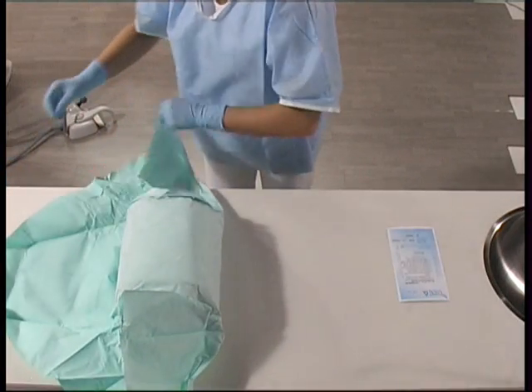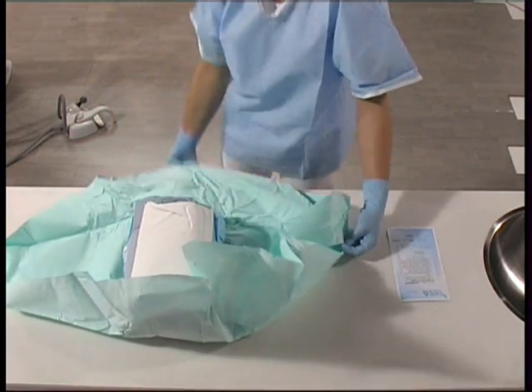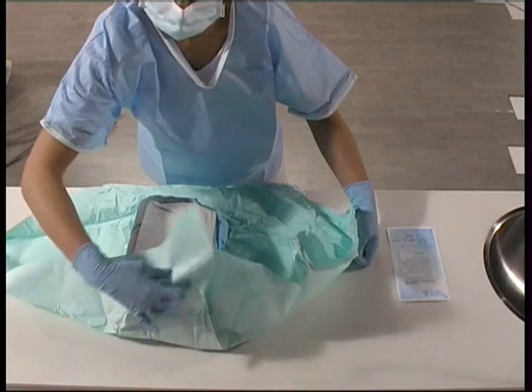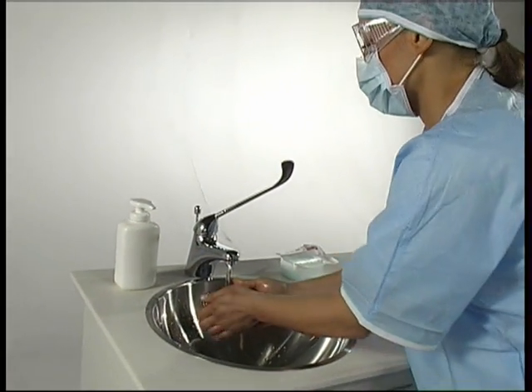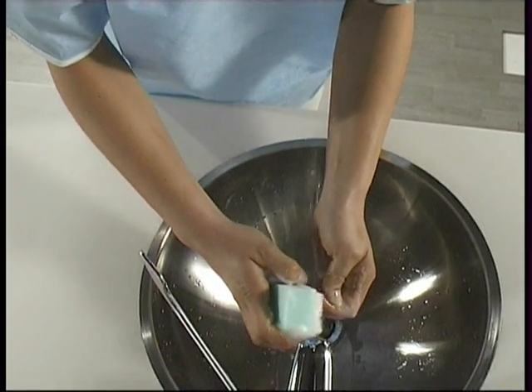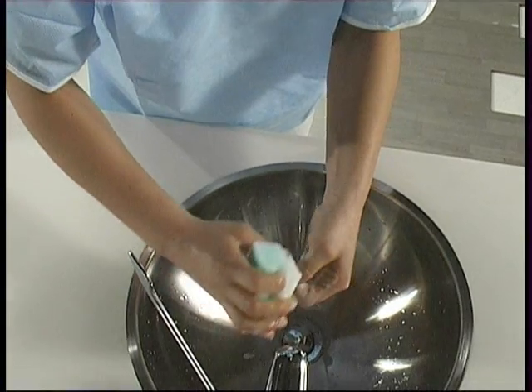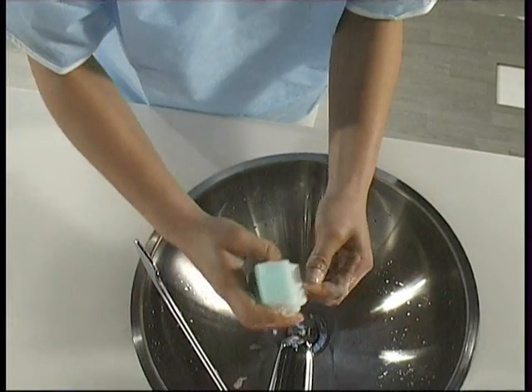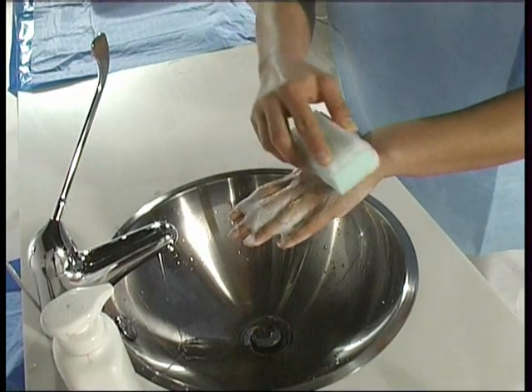The assistant then puts on the garments required by the specific protocol. Having removed any rings and bracelets, she proceeds to wash her hands using ordinary detergent soap. Using a scrubbing sponge, she disinfects her hands, under the nails and her forearms. The purpose of this procedure is to reduce the resident bacterial load.